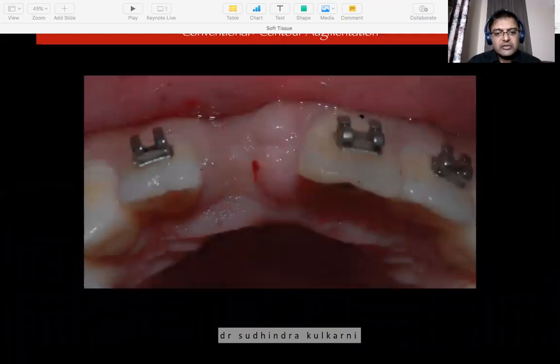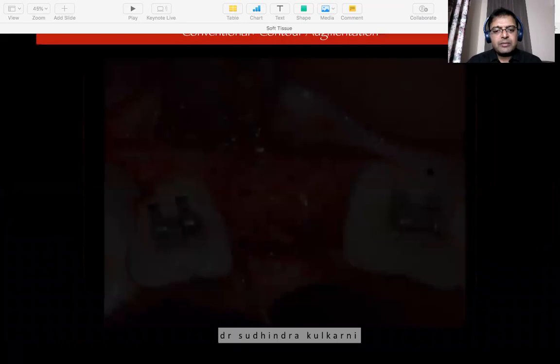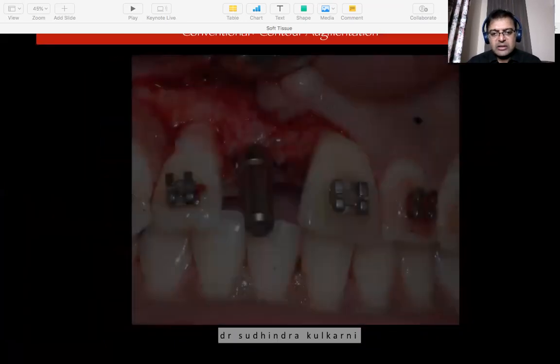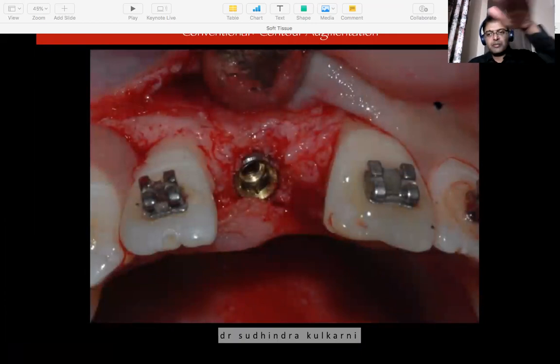One of the other techniques to achieve soft tissue outcome is hard tissue grafting. You cannot discount the role of hard tissue grafting. There are times when we place the implant in the right location. As you can see here, the implant has gone well, but you do not have ideal contour. You see there is always a buccal depression.